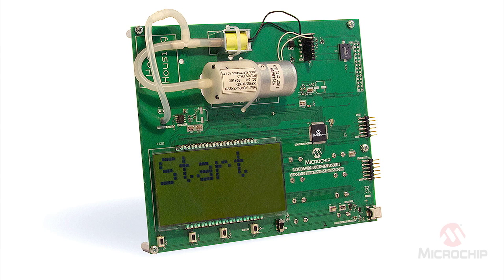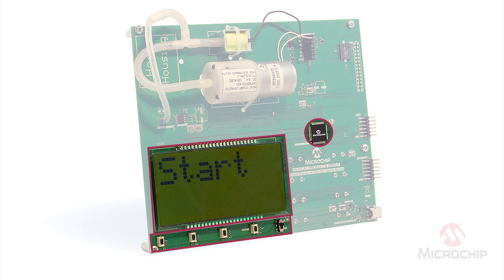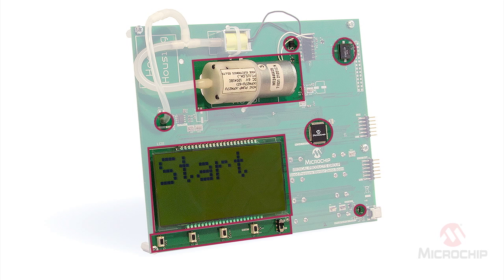You can see there are very few components on the board: the MCU, the display, the buttons, the motor, the motor power switch, a regulator, the buzzer, the pressure sensor, and a single instrumentation amp.